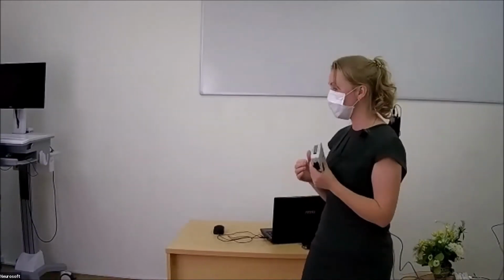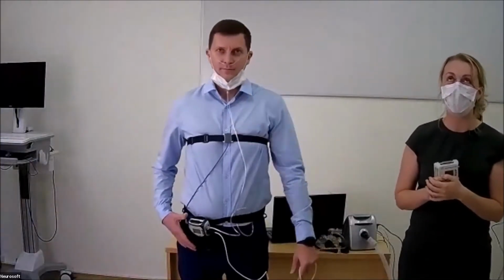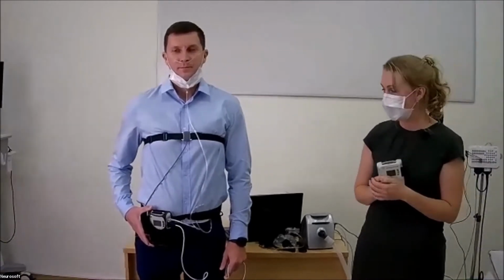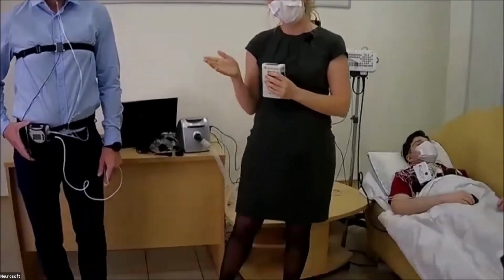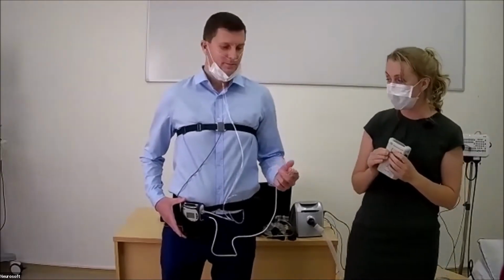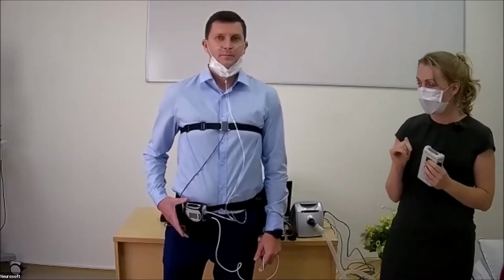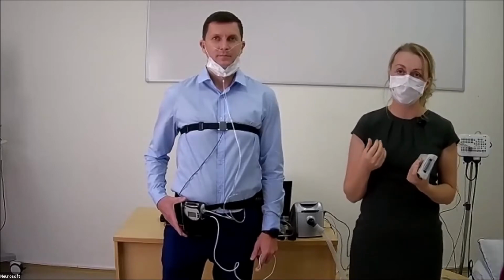I'd like to show you how our patient looks when we put on electrodes and sensors for cardiorespiratory monitoring. This is Alexey, our EEG product manager, who agreed to help us. If we compare our patients, Alexey and Anton, you see that this is an easier test because there are only a few channels for cardiorespiratory monitoring. We can use a cannula in this case, but we can also use a thermistor. We use a respiratory belt for detection of respiratory effort.